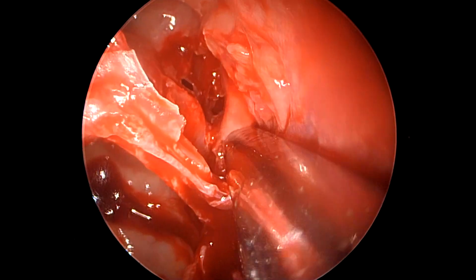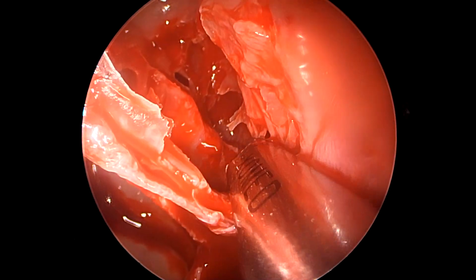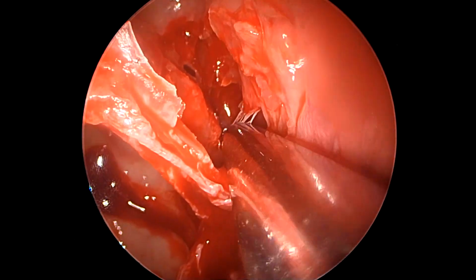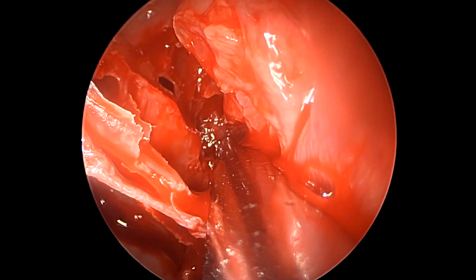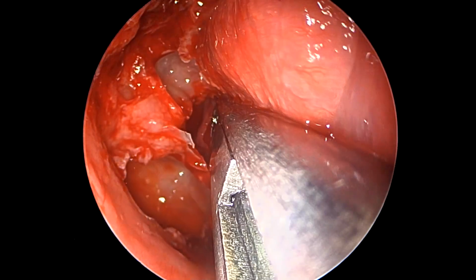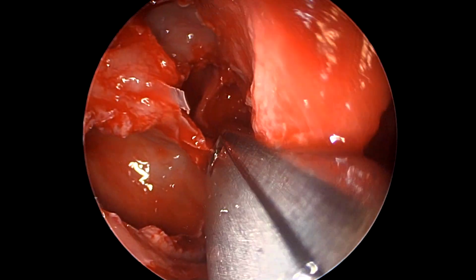As we can see here, the first main structure that comes once we enter the posterior ethmoidal cavity is the superior turbinate, which is now being trimmed in its inferior half. We leave the superior half normally because of its role in having the olfactory mucosa in it. The inferior half of the superior turbinate head has been resected with a microdebrider blade. One could also do it normally with a straight true-cutting forceps as well.